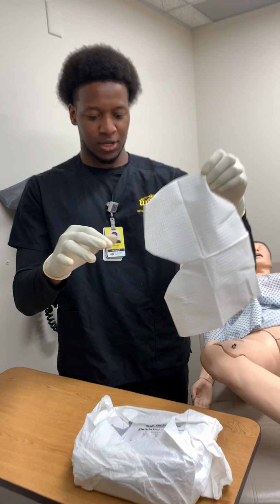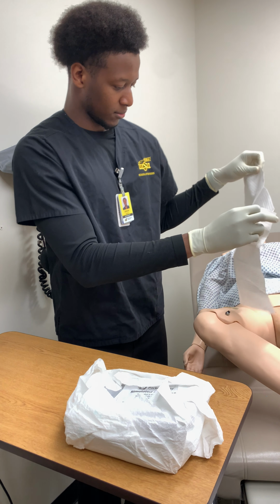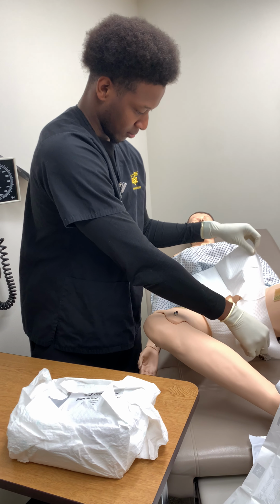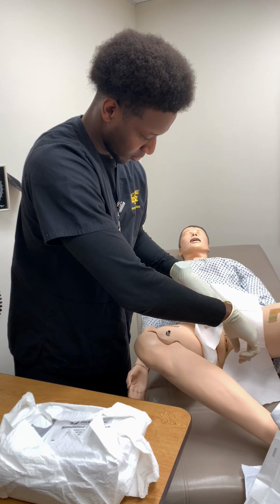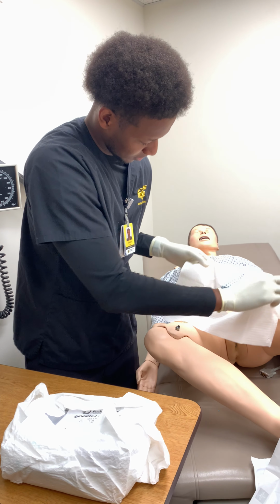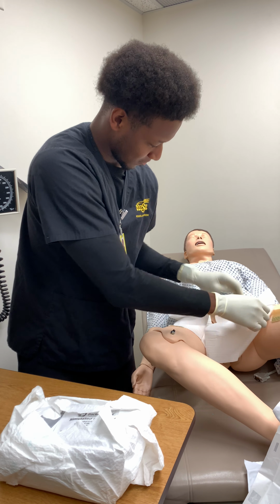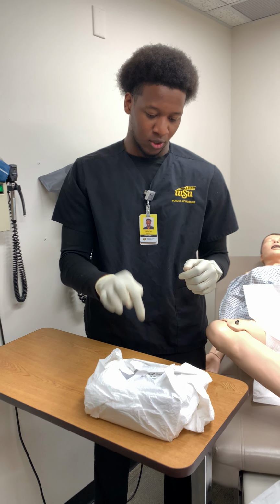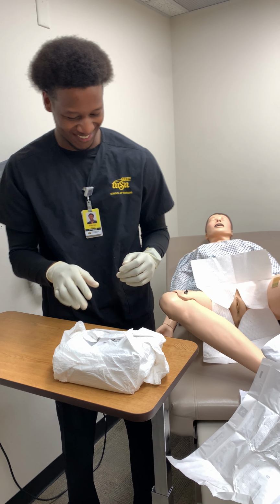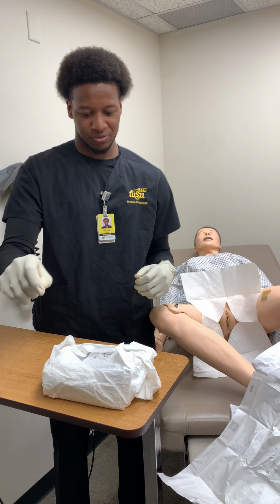Everything is sterile inside here, so sterile can touch sterile. It's supposed to drape the other way. It's okay. From there, we'll open the Foley catheter. Well, we'll start by opening it away from us in this case, then in that order.